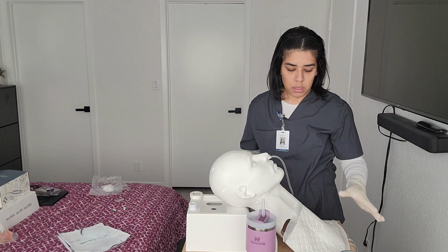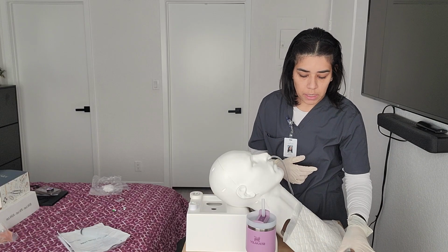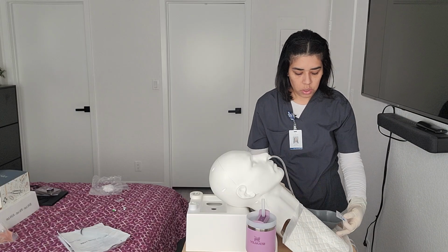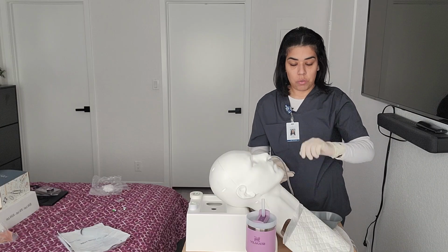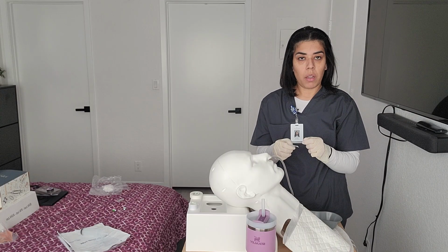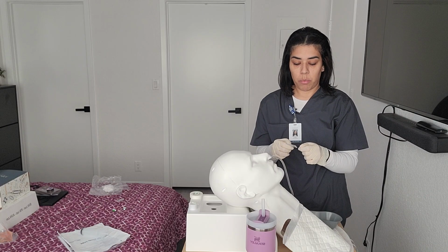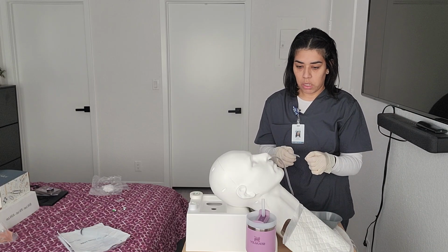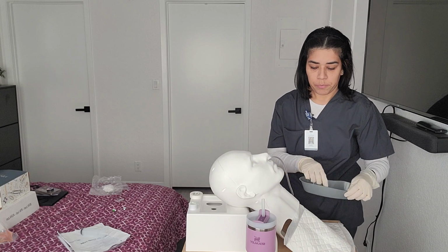Okay. And while we're waiting for x-ray again, we're gonna go ahead and check the pH with the strip. Dip it and hold it against the bottle. Make sure that it's good. 3.5 to 5 is the pH that we want, and it matches on the patient. Perfect.